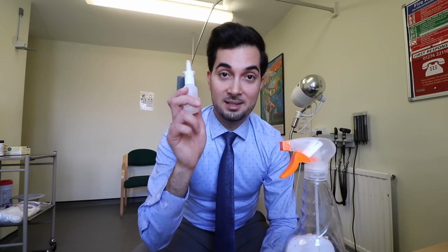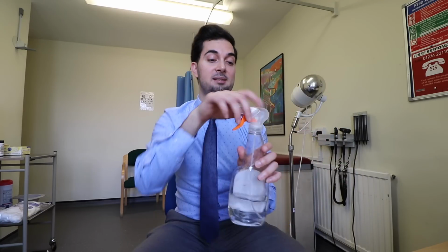Now let's look at this. It also works in a similar way to your nasal spray. Now I know it's not a medical device, but the reason I'm showing it to you is that you'd never spray it like this, would you? Because if you did, you'd quickly learn that it doesn't work. Which is precisely why you should always hold your nasal spray upright when you're using it. Because just like the other example, if the feed tube isn't in the solution, it's not going to work properly.